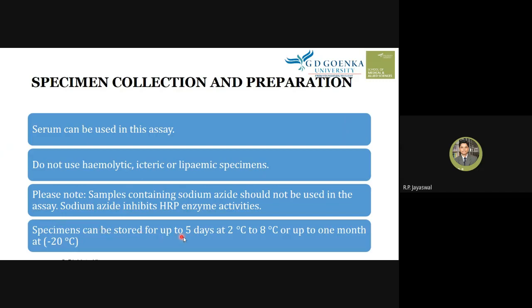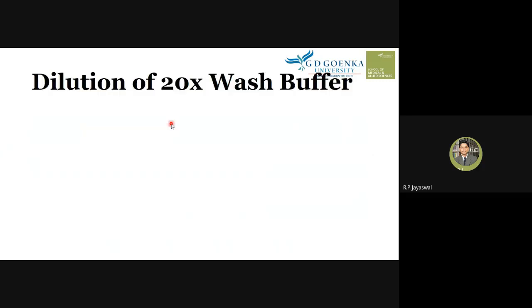Specimens can be stored for up to 5 days at 2 degrees Celsius to 8 degrees Celsius, or up to 1 month at minus 20 degrees Celsius. So this is the specimen collection, preparation, and storage.